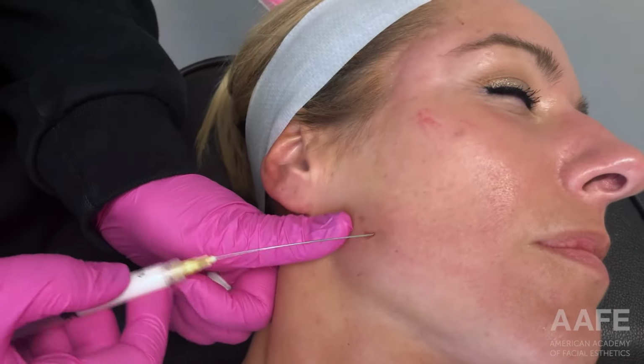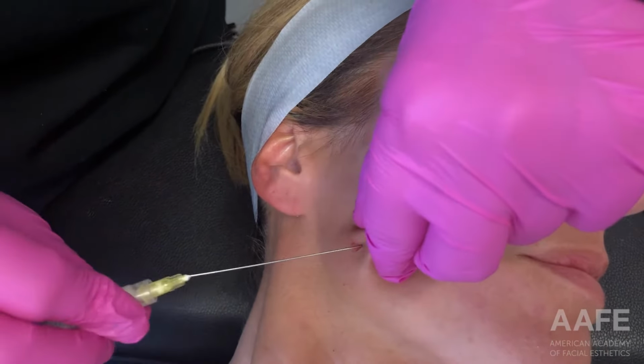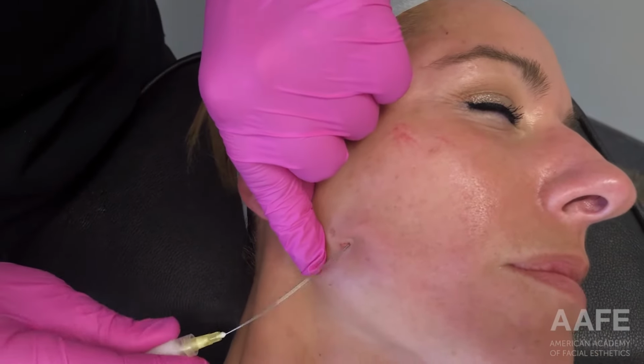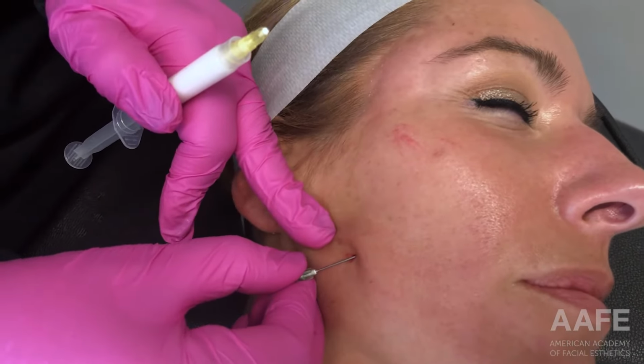So we're just trying to pop back into our plane here. Sometimes when you pop out with your cannula, it's harder to get back in. But once you get back in, we're just going to continue to fan the material. Sometimes it requires going back in with your pilot needle, which is completely acceptable.